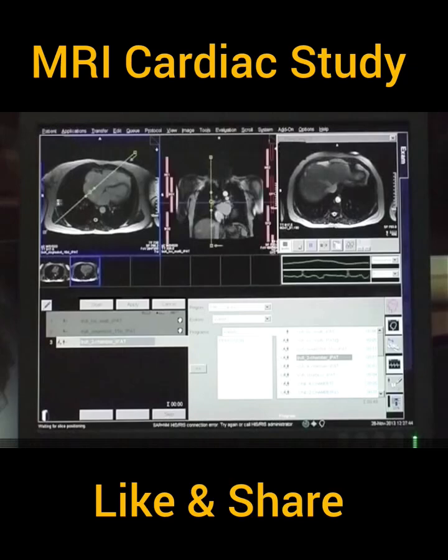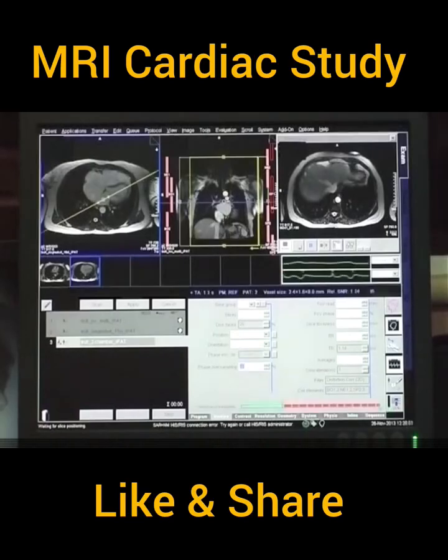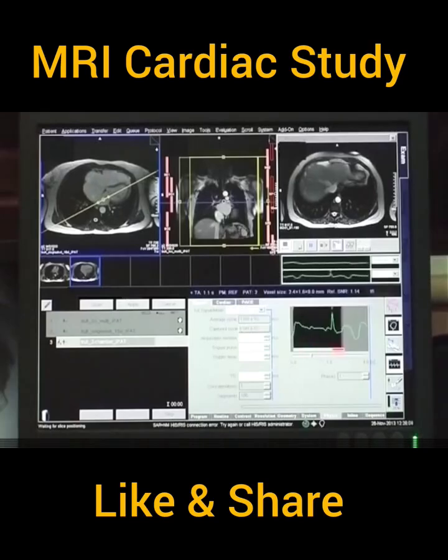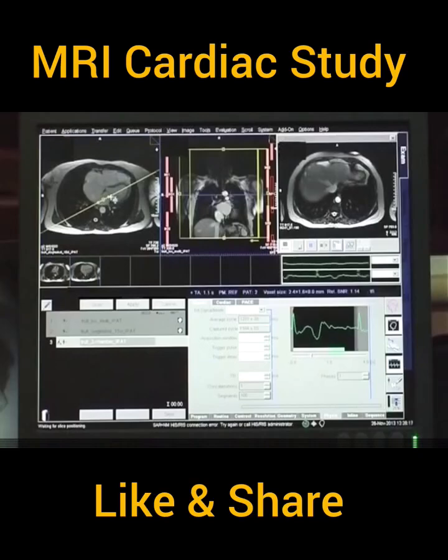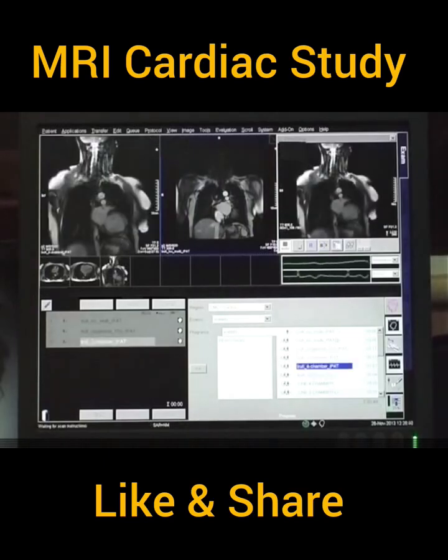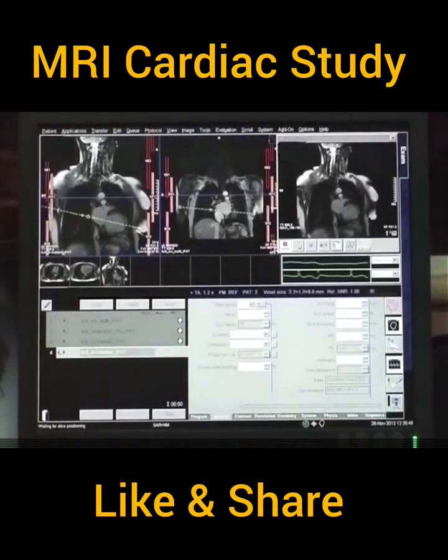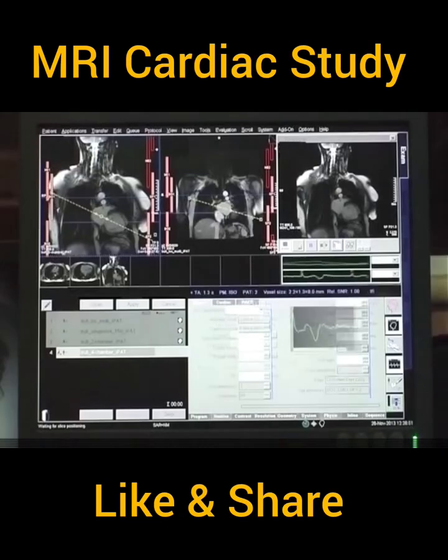On the true axial view, a line is drawn through the left atrium, the center of the mitral valve, and the left ventricular apex. To obtain an approximate 2-chamber view, in this approximate 2-chamber view, a line is drawn through the left atrium, center of the mitral valve, and the LV apex.